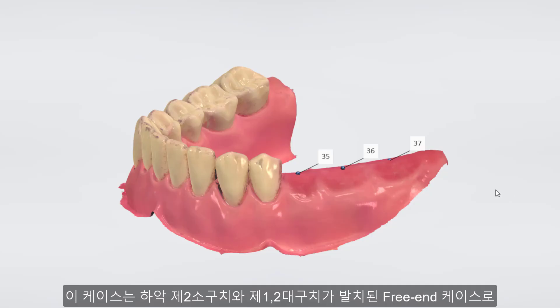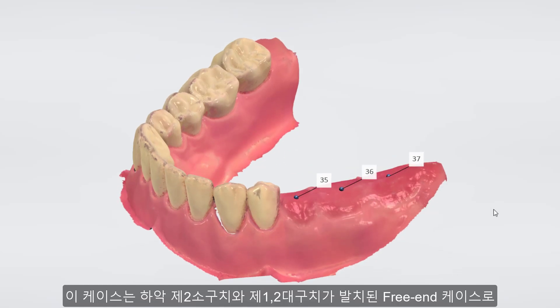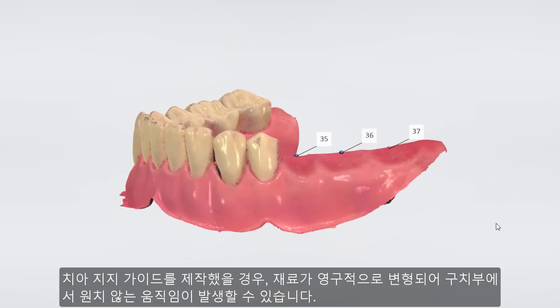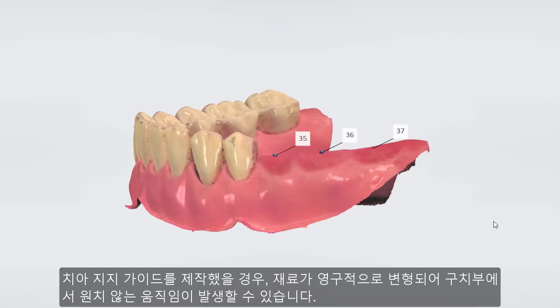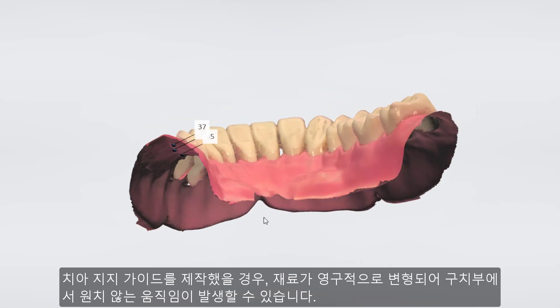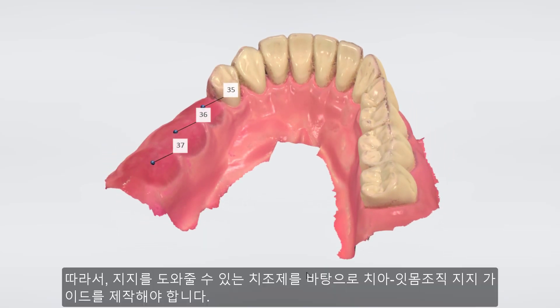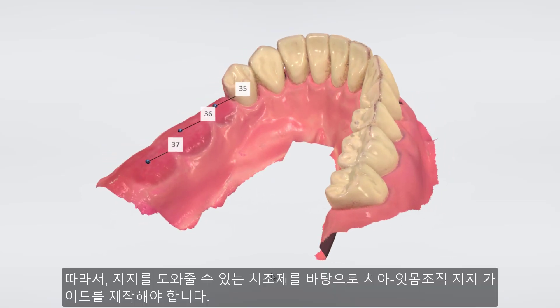In this case, the patient is missing the second premolar and molars in the lower jaw, so it's a free-end case. With a simple tooth-supported guide, the plasticity of the material would give us an unwanted movement at the posterior end. This means we have to use the crest for support and create a tooth-tissue-supported guide.